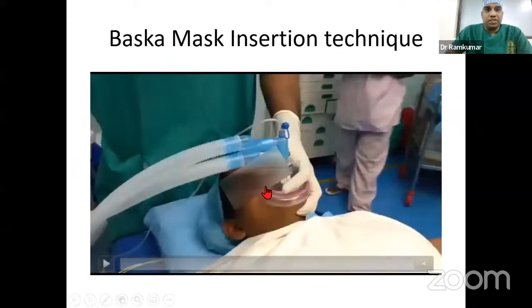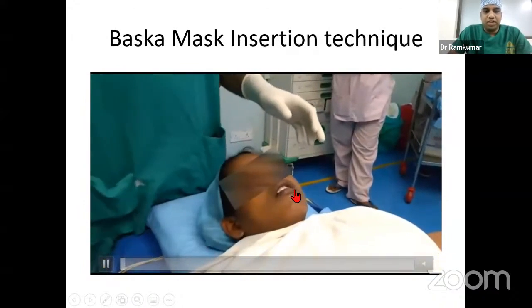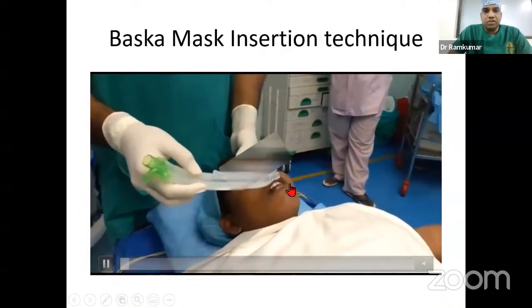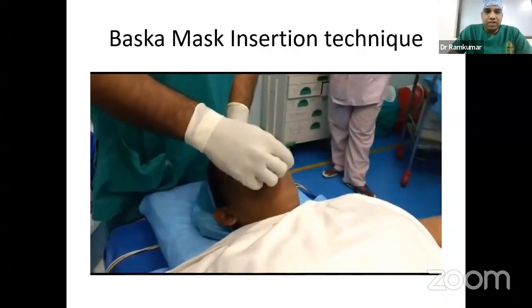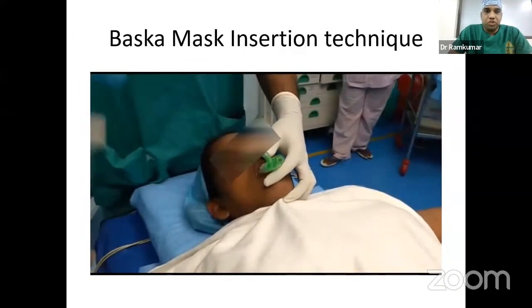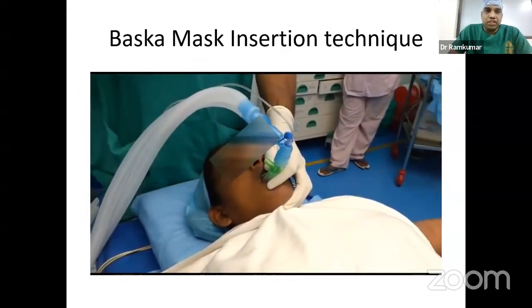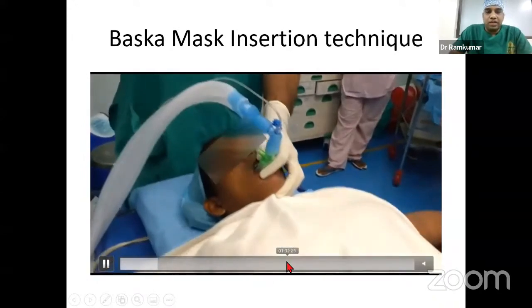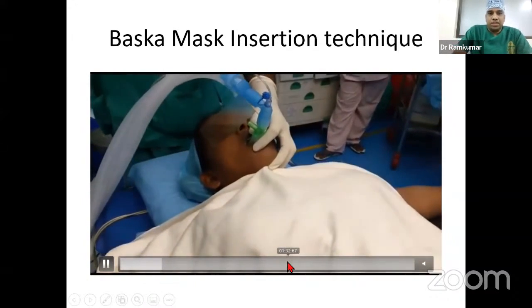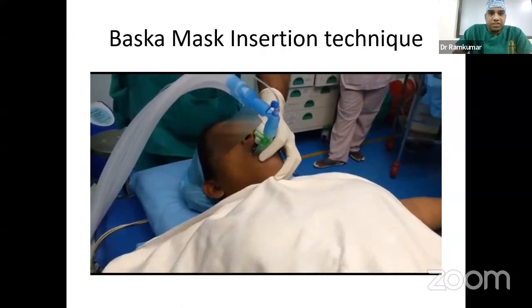Coming to the other device, the Baska mask insertion is quite different. Here the device is lubricated on either surface with water-based jelly, and the lip is also lubricated. The device is quite bulky, but this is how it's inserted. You get a very good sniffing position, just insert it because it's a soft silicone tube. It smoothly squeezes itself into the hypopharynx, so it doesn't require any manual mouth opening or a distal insertion technique. So we can insert it within a few seconds, less than 10 seconds.